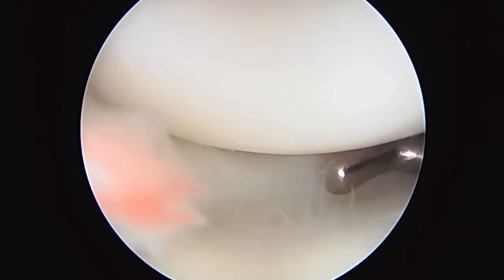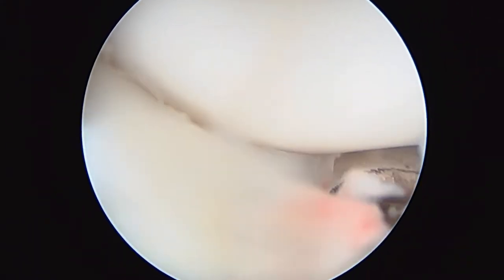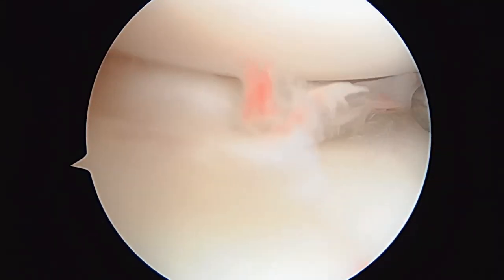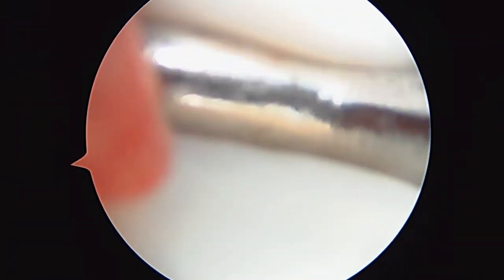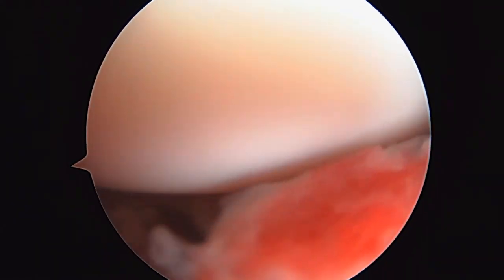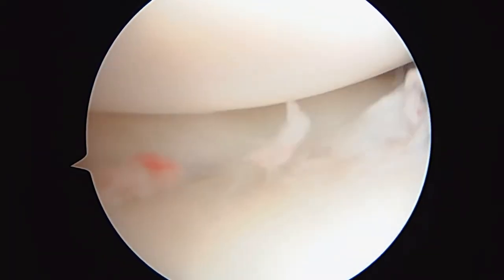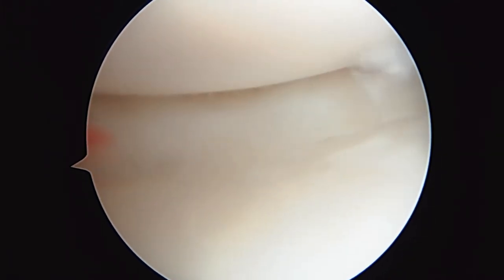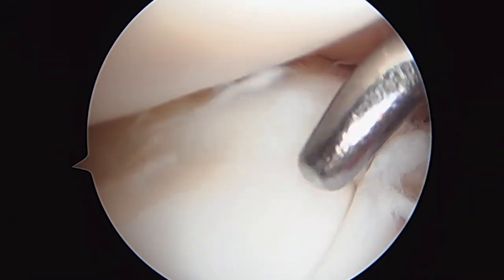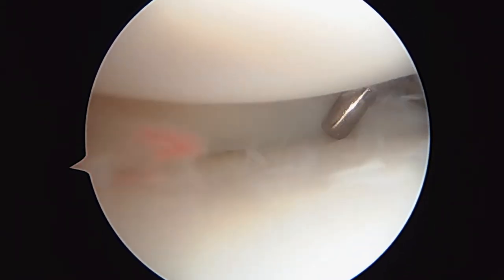We're in the lateral compartment, getting our first look at this bucket handle tear in the lateral meniscus, which is not a great problem to have, but I think we can fix it. I'm trying to reduce it right now, get it back in position. I'm trying to see where the tear stops. We're just going to get this fully defined, using our probe to help do that. Here's the tear — you can see how it displaces. We're going to do our best to put a couple of sutures in here.